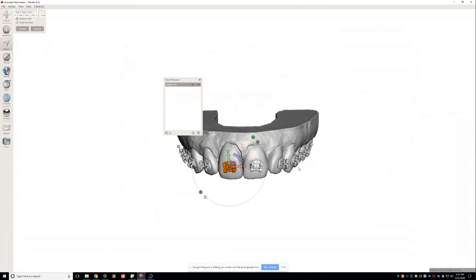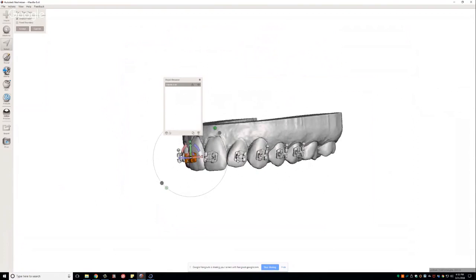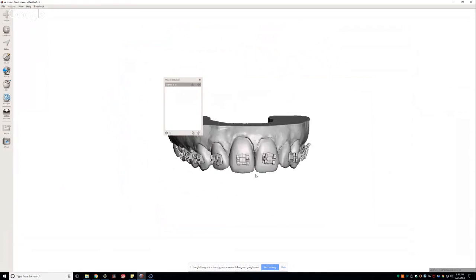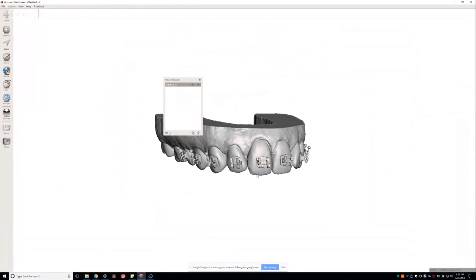Well, the same thing with buttons, you overcorrect. I showed those two triangular buttons that I would use to sweep this root. The same thing. If you're trying to close a diastema, you need to overcorrect those teeth. You need to pretend that you're bringing them kind of pigeon-toed, the roots too close together, so that you're overcorrecting, because your teeth will always lag just a little behind in plastic. But the same way with the brackets. So yes, you can close diastemas.